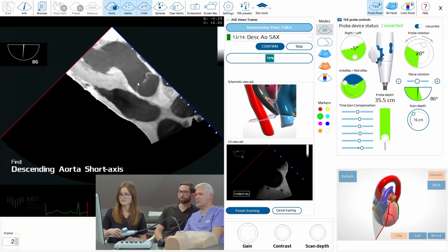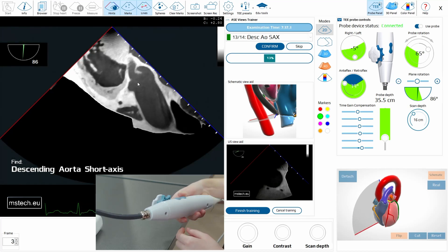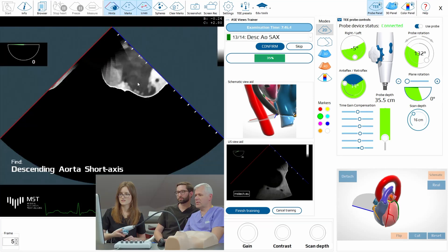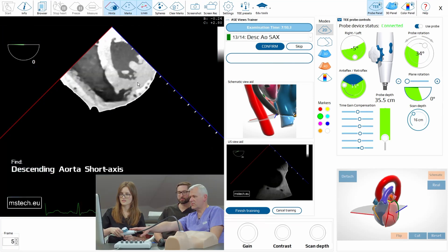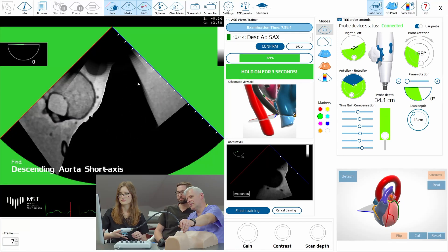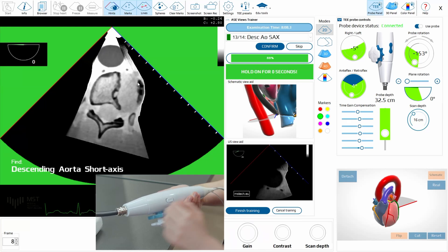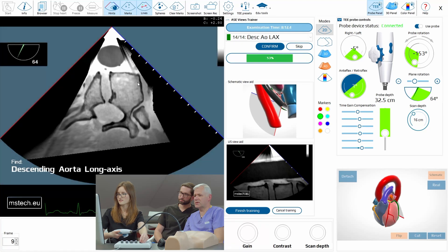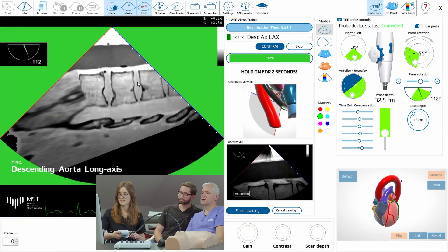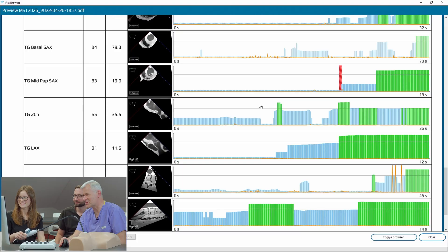Now aortic short axis view — descending aorta. So we should turn. At the back. What plane rotation would you use? Maybe the zero one. Now go to the back of the patient. You see the probe is now flexed — so release it completely, and now go back to the back. Slightly higher maybe. Put it in the center. Correct. And now long axis — so we should change the angle to 90. Very nice. Perfect. Slight adjustments. In this case it's not 90, it's 112, because the aorta is just... you passed. Just one perforation and otherwise it's fine.